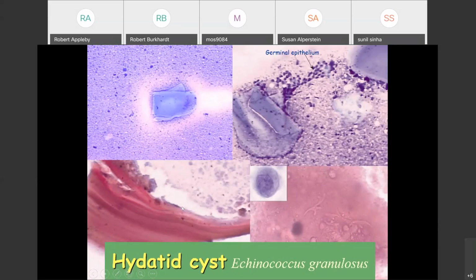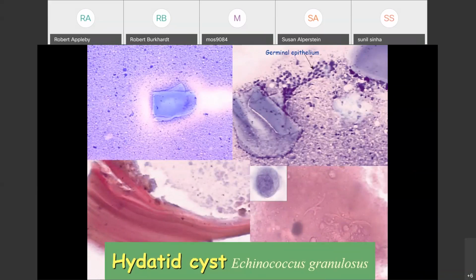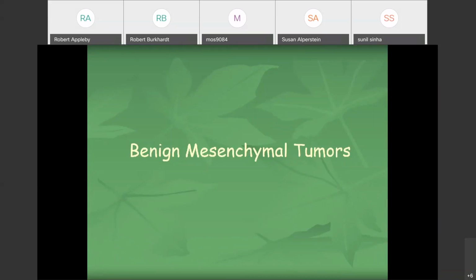Of course, this case, I wasn't that brilliant. I just say benign liver cyst. And then the clinician was so brilliant. He called me up, said he suspects patient has the hydatid cyst because she's from Bosnia. And then he asked me to review the slides. And now I know what to look for. And so this is the case. And then benign mesenchymal tumors in the liver.